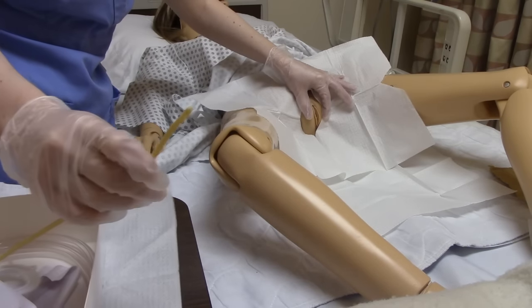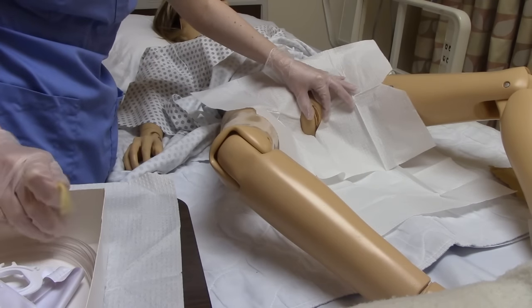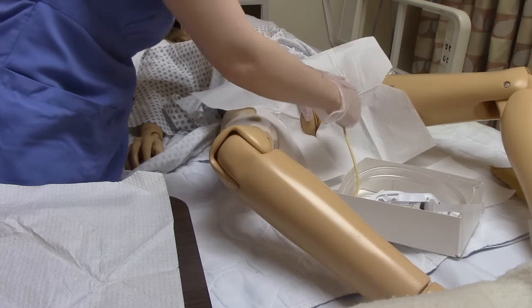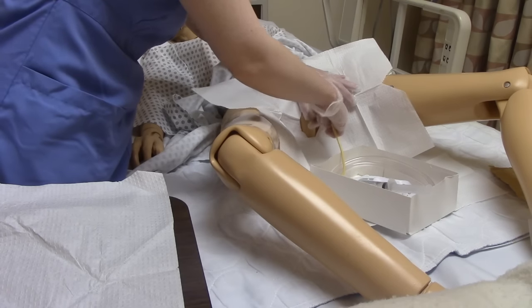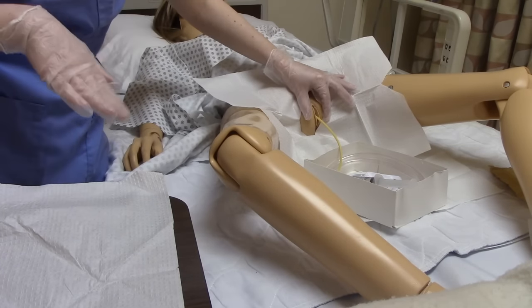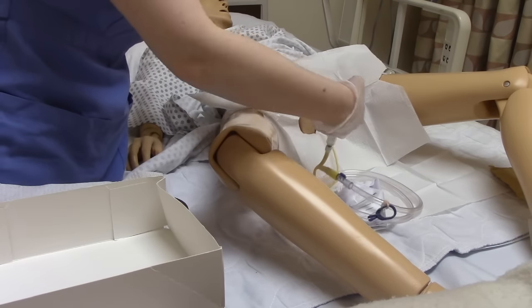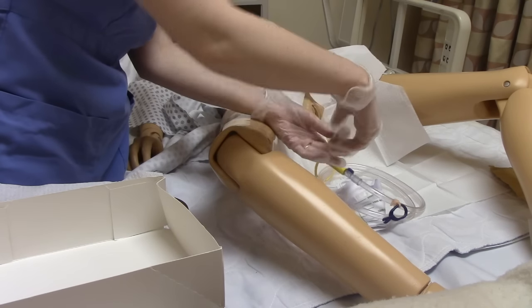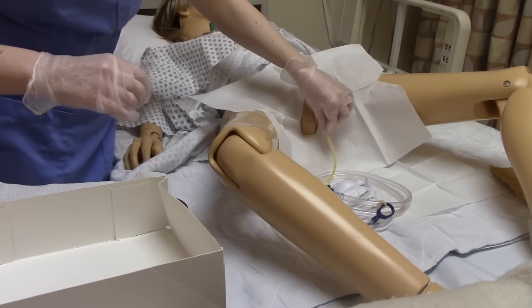We're going to take our catheter, dip it in our lubricant, and then we're ready to insert it into the patient. Have them take a deep breath — tell them it shouldn't hurt but might be a little uncomfortable. Insert until you see urine return. Once you see urinary return, you know you're good. We don't have to be sterile anymore. We can inflate our balloon. Once the balloon is inflated, give it a tug — that's how we know we're in and it's not coming out.